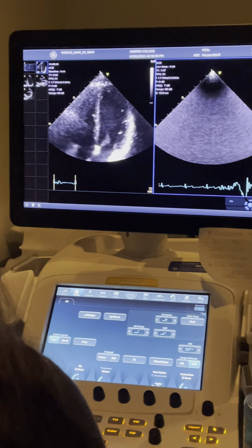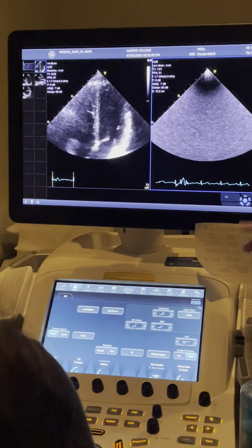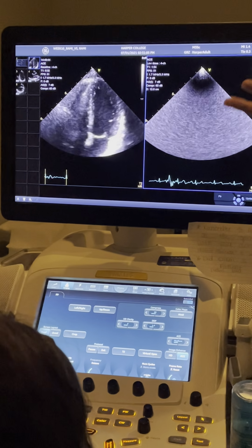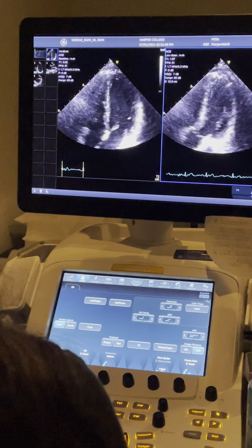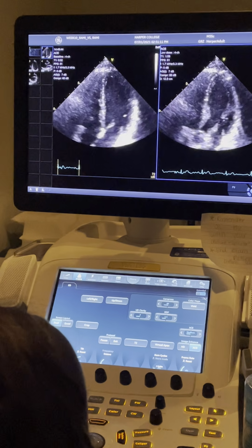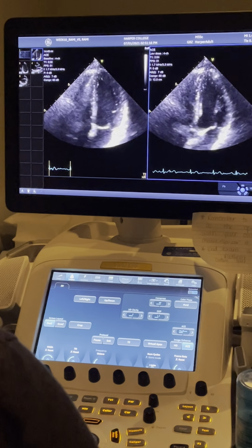So what would have happened here is you wait, the nurse has started the dobutamine drip, it's infusing. We're watching our heart rate to see if it comes up just a little bit. We don't want it to be the same as rest. It should uptick, but typically it's still under 100. It just depends on the protocol and how rapidly they're infusing the dobutamine.